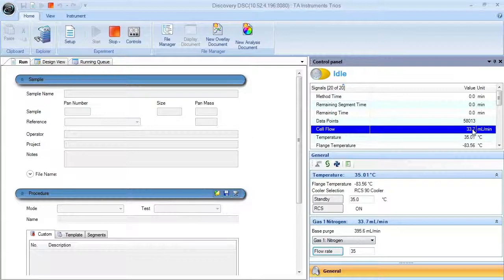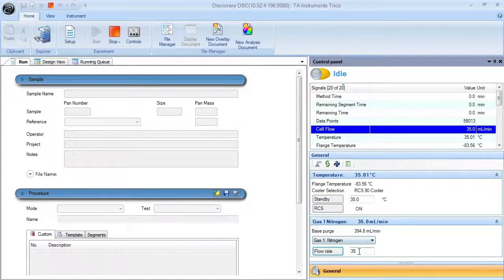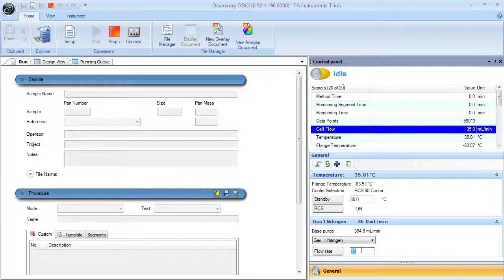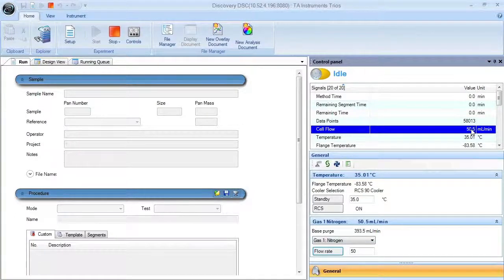Note that the measured flow rate will be updated in the signals panel. You may also select the default gas selection from this window.